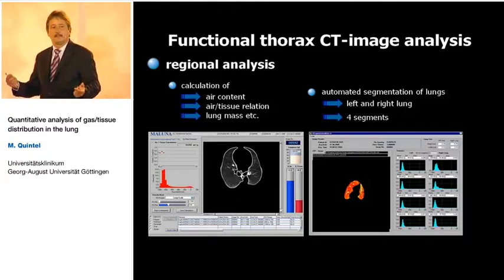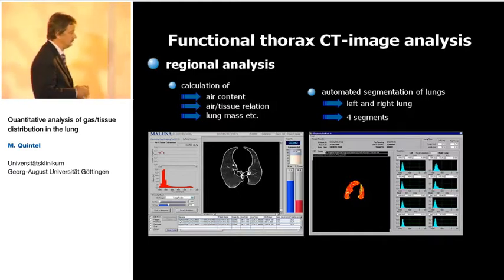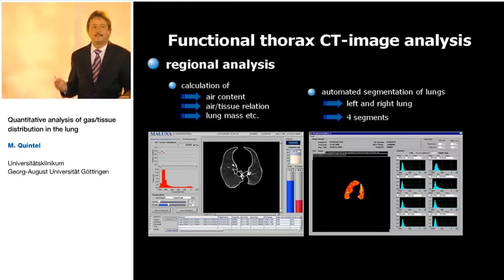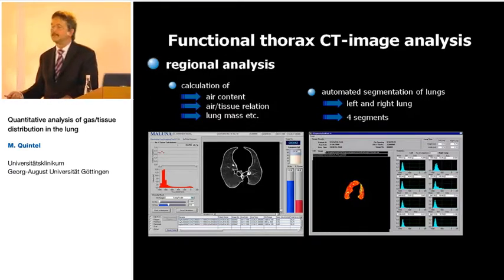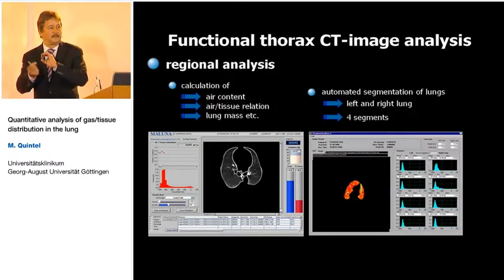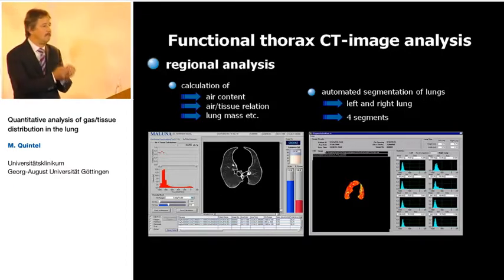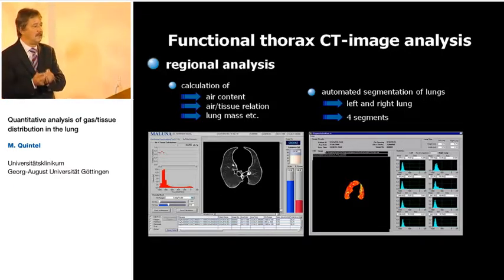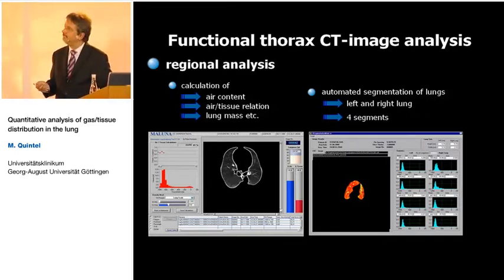However, now it starts to become problematic, and Luciano already went into this discussion. If you say, now let's look at 4 ROIs, regions of interest, how do we define them? Should we define them in centimeters, which means you look at different volumes, or should the definition be that we compare comparable or equal volumes, which has to be defined in advance?